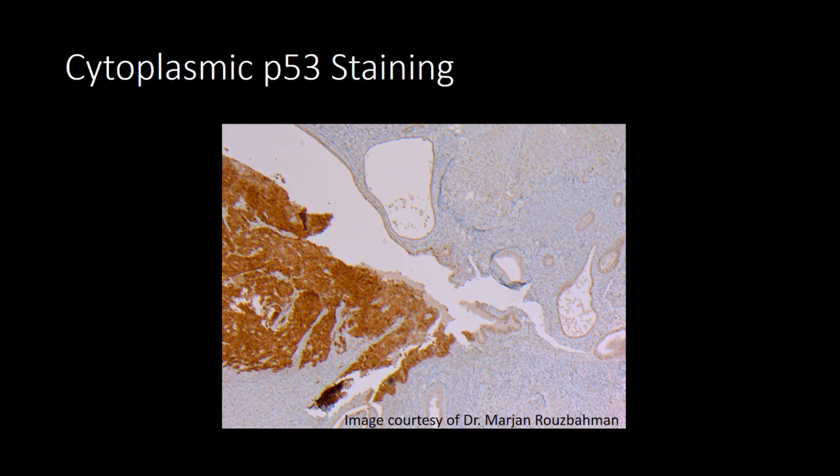And so if you do see cytoplasmic P53 staining, that's not just funny staining, that's actually a mutant case, and you should hold that to the same standard as null or mutant staining with P53. So there are 3 patterns that you need to be aware of and keep those in mind when you're looking at these cases. And so that's learning point number 2. Keep in mind your nuclear atypia on small biopsies.